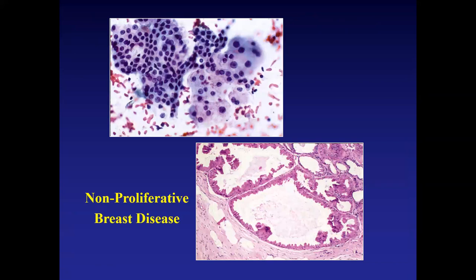Let me take this opportunity and go through how the whole spectrum of what we used to call fibrocystic change looks. I have created a sort of cytologic system that corresponds cytological features with morphological features, known as the Masood Cytology Index. And that is based on that comparison.